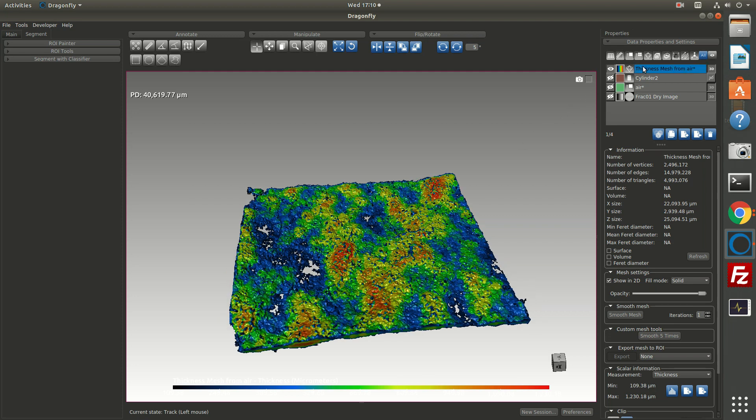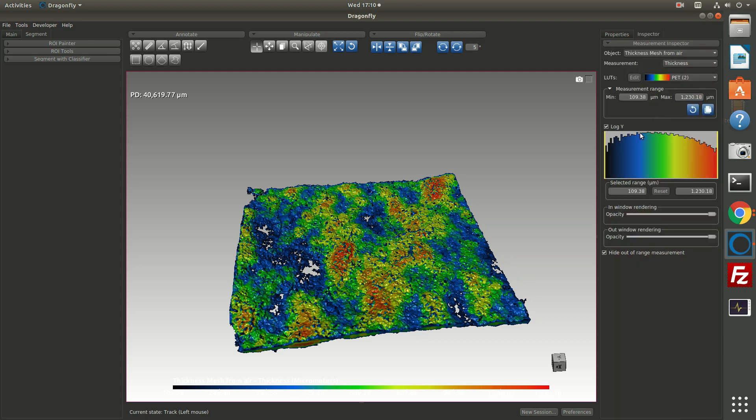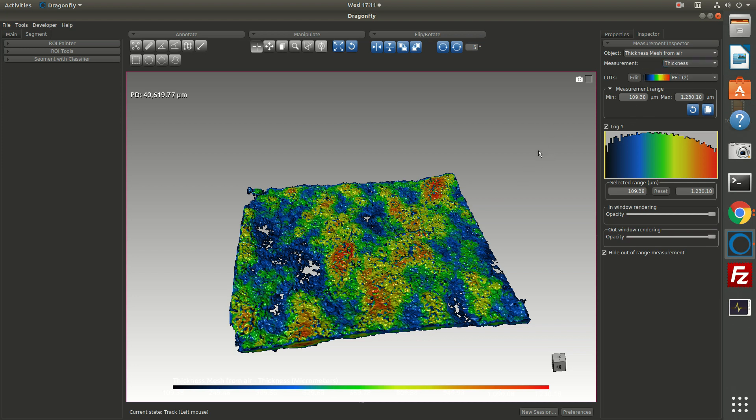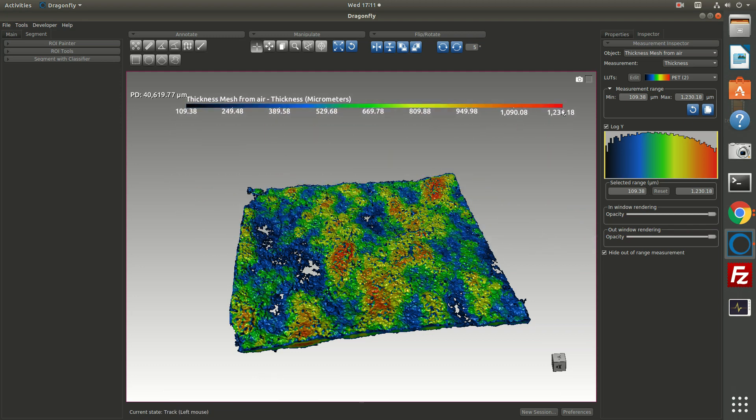So I'll also point out that if you wish to right click on this, you can pull up something called the measurement inspector, which is this panel. This mesh has thicknesses mapped on all the vertices. If you had some other mesh, you might have simulation measurements mapped on the vertices or other attributes. This mesh has only one attribute, and that is thickness. And here we can control how thickness is plotted.